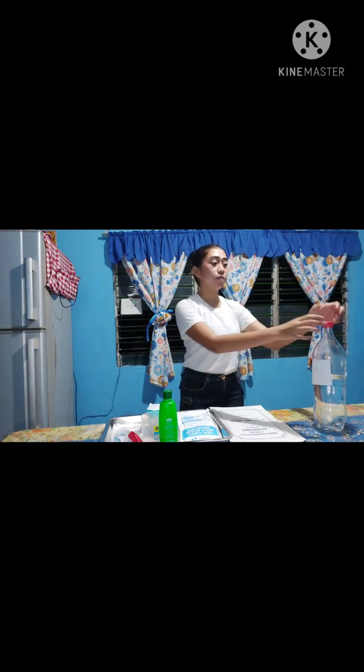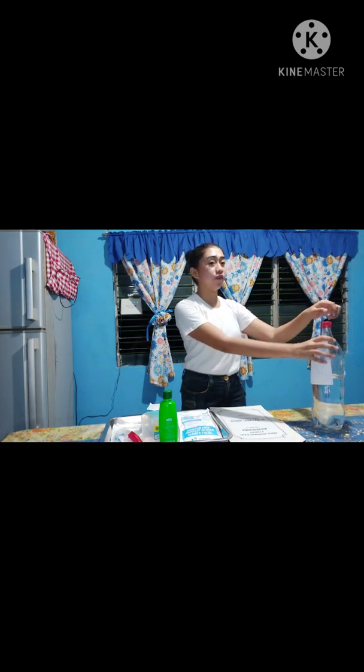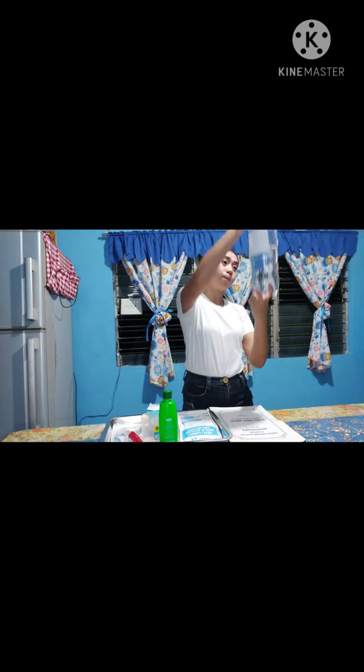The next is that we're going to proceed to the priming. The first thing we need to do is to wash our hands or sanitize with alcohol to reduce the transmission of the microorganisms that are present. And then, remove the protective cap of the solution bottle. So this is the protective cap of the solution bottle for the preparation of intravenous infusion. Then, make sure that the solution bottle is completely sealed and check for any leakages. And make sure the solutions are clear.